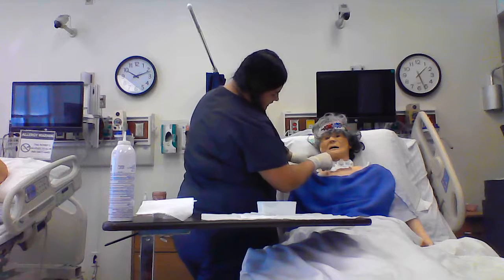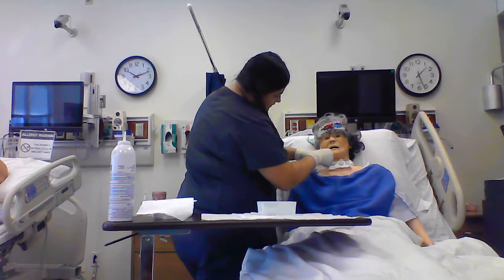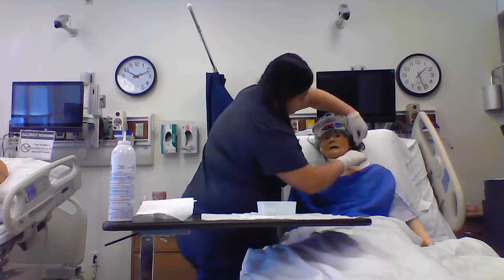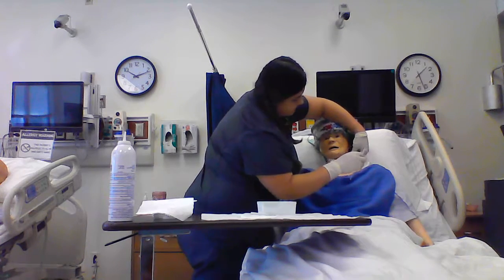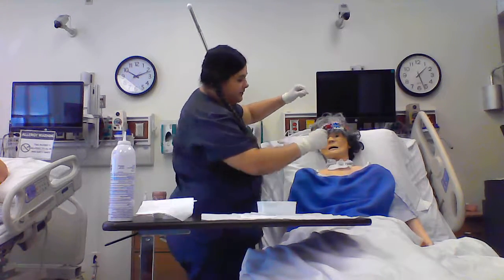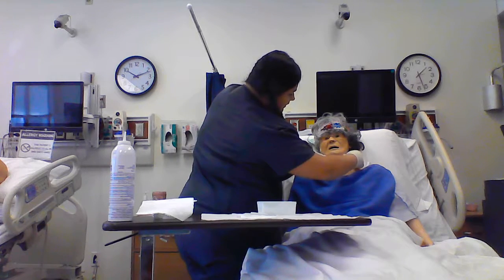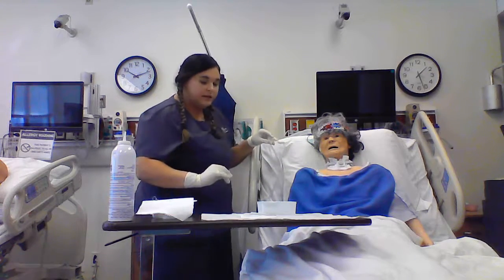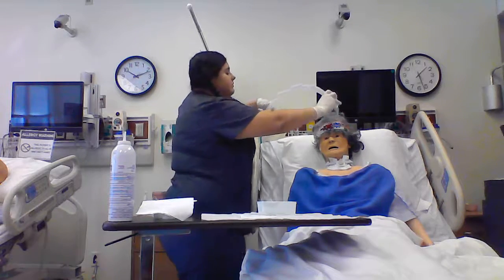At this point, I'm going to go ahead and contaminate my non-dominant hand. That way I can move these trach ties out of the way. Okay, I'll throw that Q-tip away. I grab these and make sure that the sponge is around my patient's tracheostomy appropriately. And now I'm done. I'm going to re-oxygenate my patient.